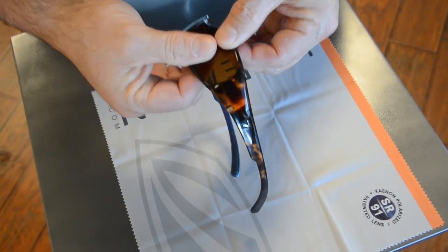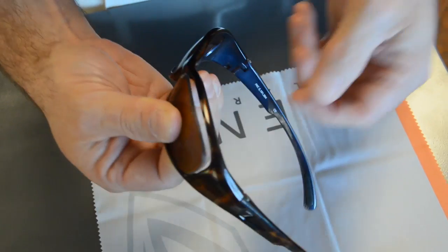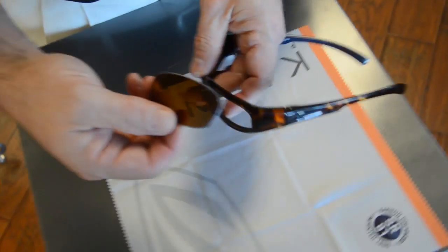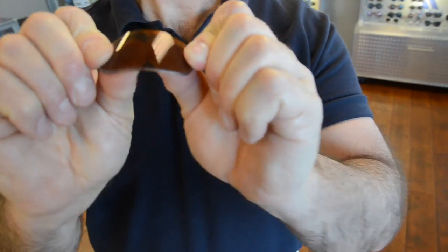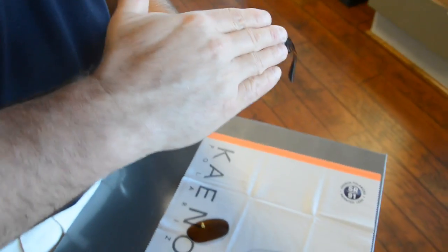We pull it apart, rotate our fingers, and the top comes out first. To put it back in, the lens has to be flexible. Any polycarbonate, Trivex, or plastic lens would be that flexible.